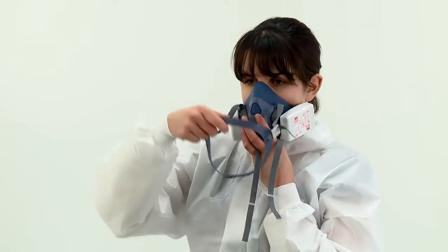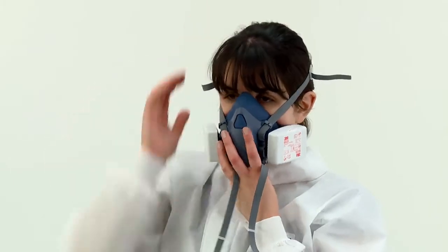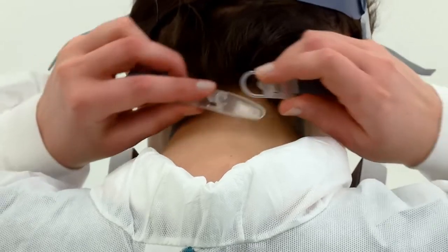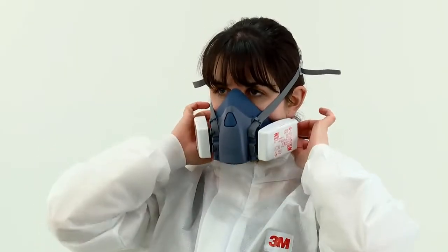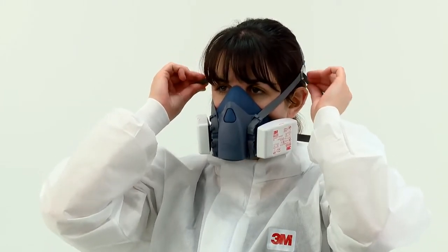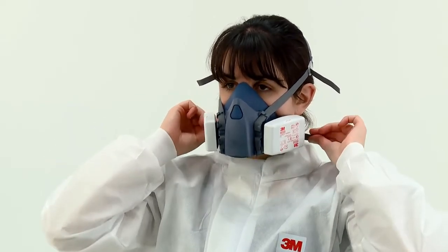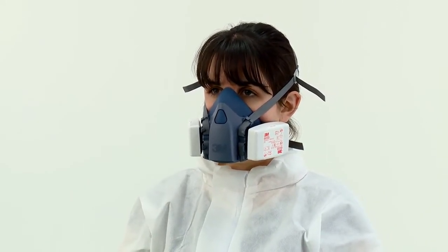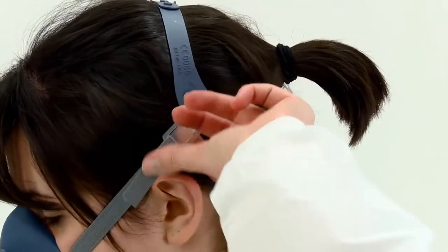Then pull the head harness over the crown of your head. Take the bottom straps in both hands and hook them together behind your neck. Ensure the straps have not become twisted. Tighten the top head harness first by pulling on the ends of the straps to achieve a comfortable and secure fit. Tighten the bottom straps in a similar manner to secure the respirator. It should feel snug against your face, but take care not to over tighten. Strap tension can be decreased by pushing out on the back of the buckles.